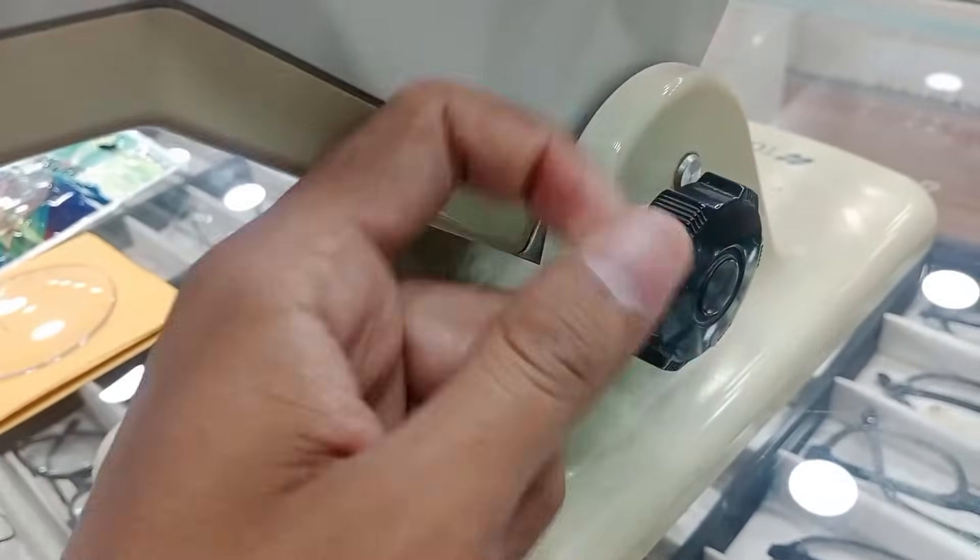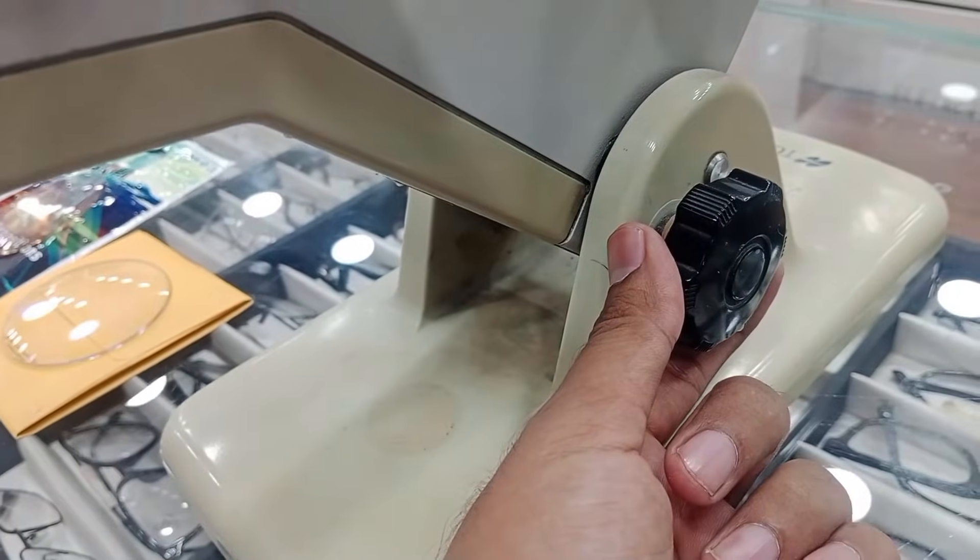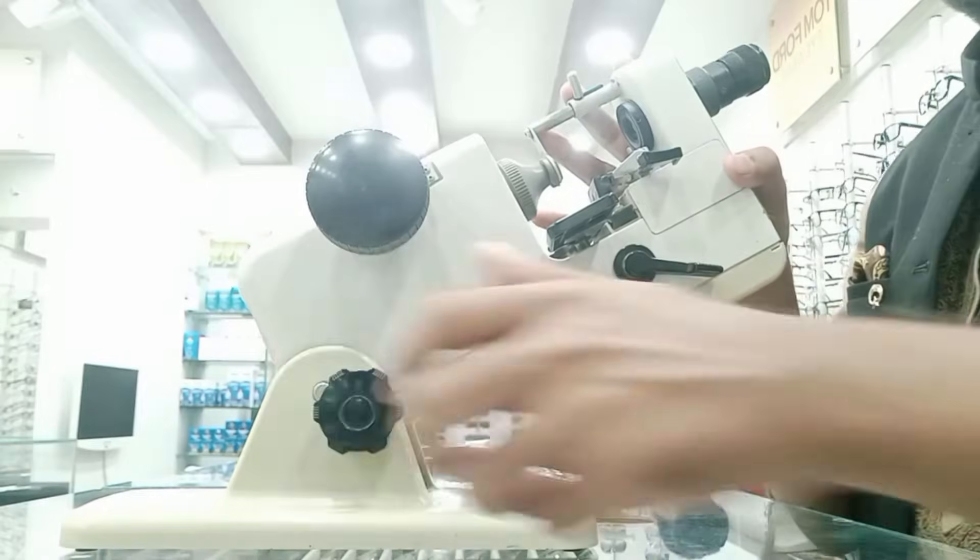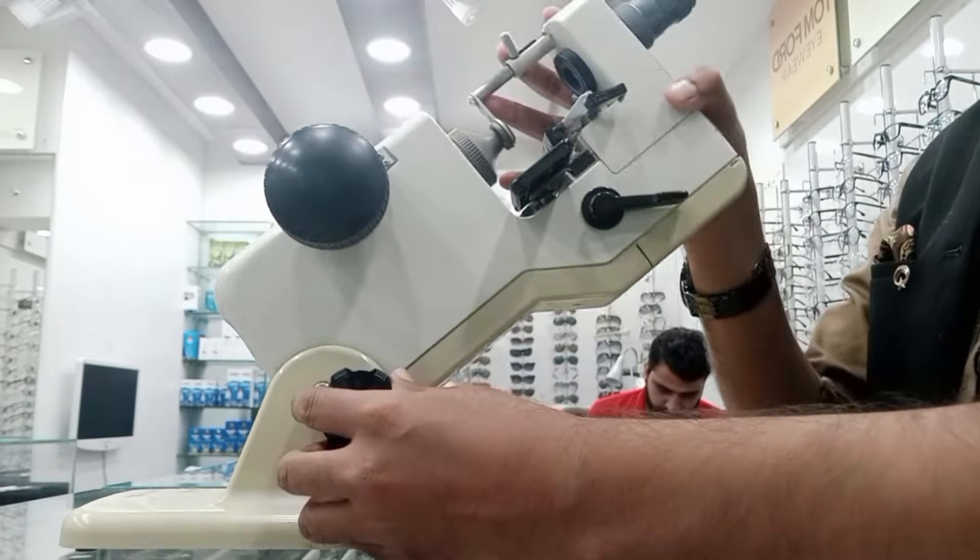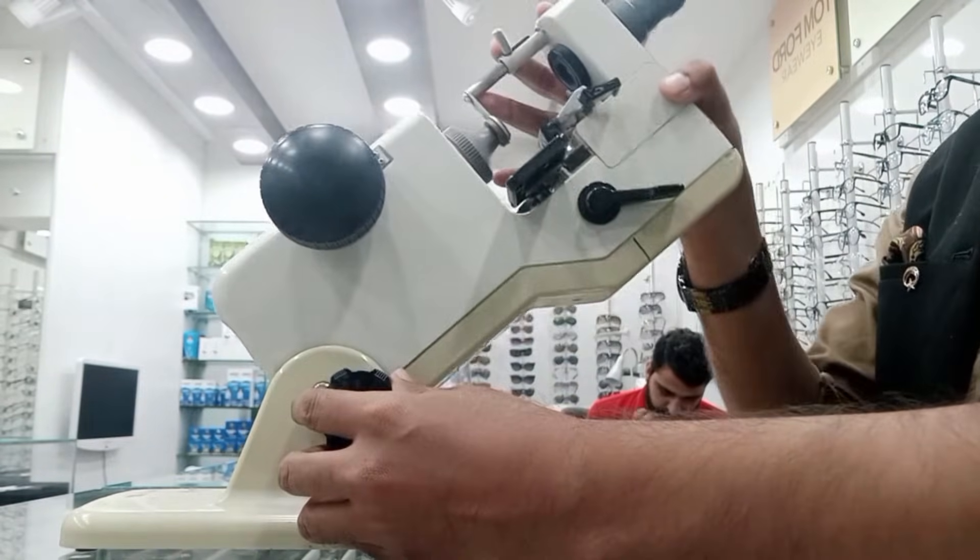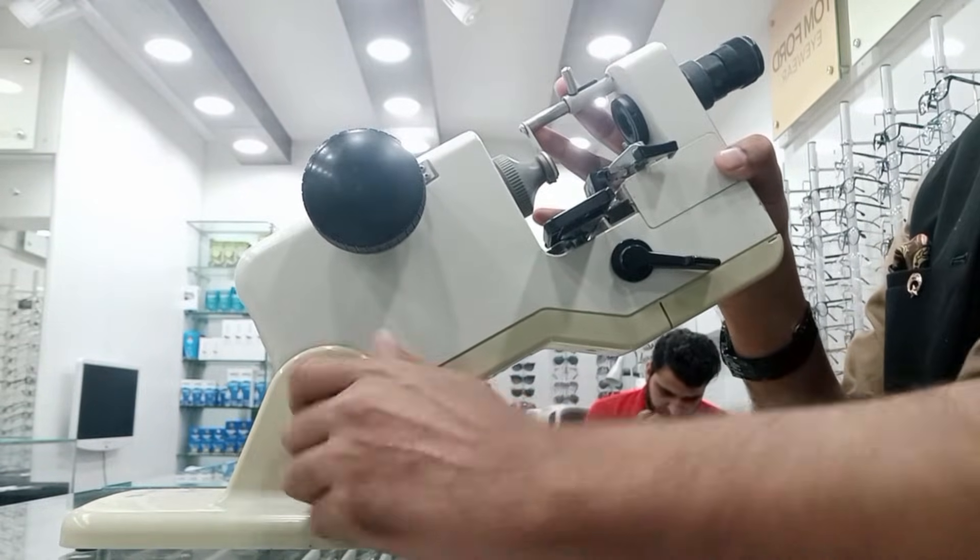The red color is for negative lenses minus, and these are for plus lenses. And this is to adjust the height of the lensometer. You can move and adjust the height of the lensometer.